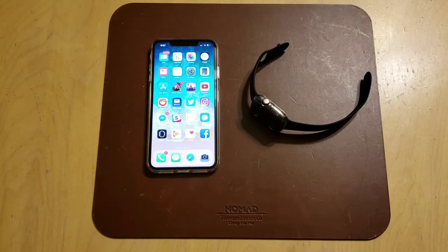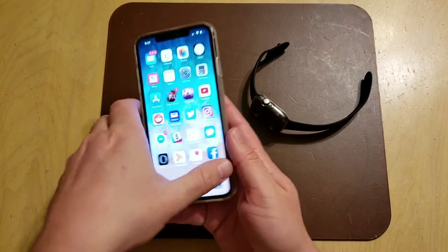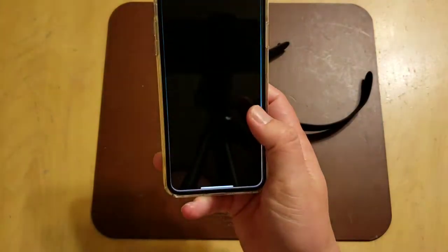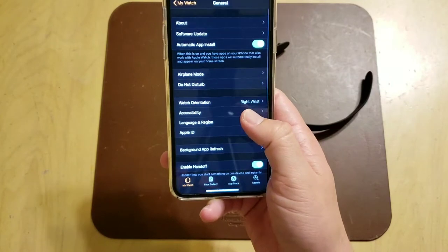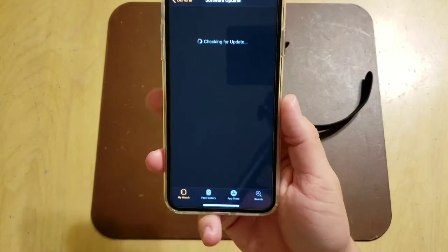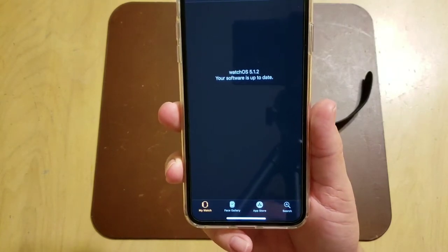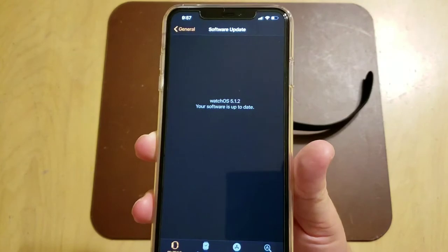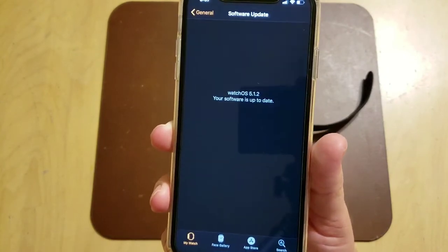There are two important things: one is making sure that your phone is running the proper OS, and two, making sure that your watch is running the proper OS. The update came out today. To access updates for your watch, you have to do it using the Watch app on your phone. Go to General, go to Software Update — mine's up to date — but you need watchOS 5.1.2 on your watch.